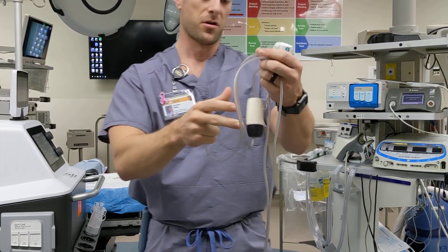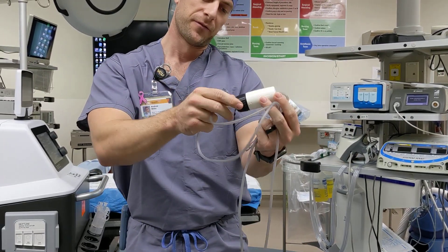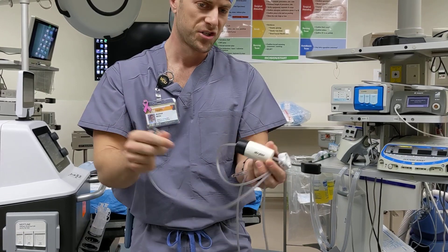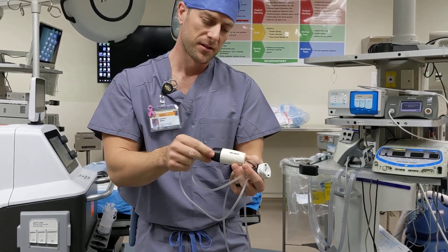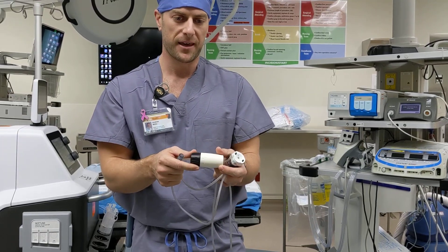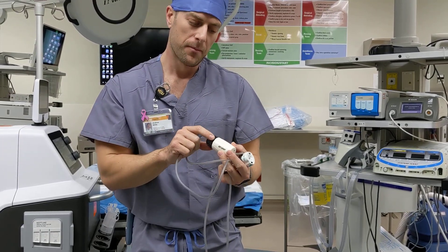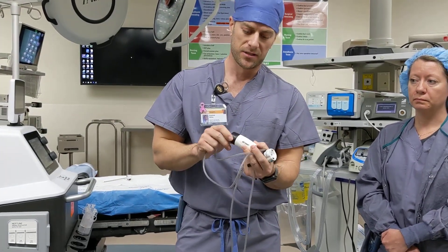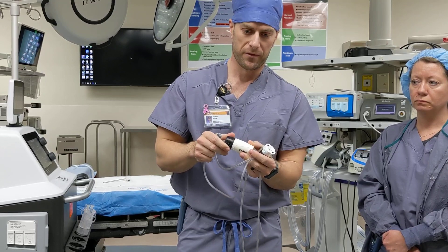This is going to be your Trocar on the field and your filter on the field. You have three settings, zero through three. Zero, you can shut off the smoke evac altogether. Three is wide open, and that's probably going to be used at the end when you want to desufflate. But if you have some plume that you want to get rid of, you can open that up a little bit to help control it from the field.